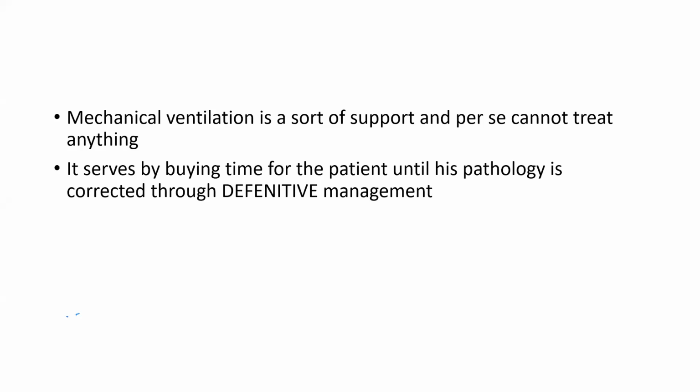Minimal in pressure, minimal in oxygen, minimal in volume, and minimal, most importantly, maybe in duration. So whenever the patient is ready to be freed from mechanical ventilation, he should not wait more. So understanding this is very important so that you know what we exactly are doing with mechanical ventilation.